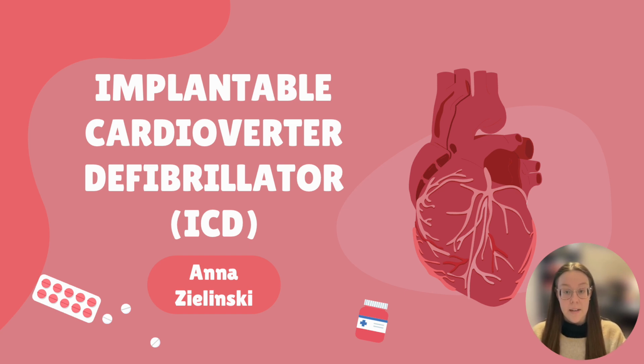I will be discussing with you today the implantable cardioverter-defibrillator, otherwise known as an ICD. To put it in simple terms, the ICD is a device that is surgically placed to help detect and treat dangerous heart rhythms. The leads of the device are attached to the heart, and the device functions by detecting the occurrence of a deadly rhythm. At this point, the ICD delivers a shock which restores normal rhythm.